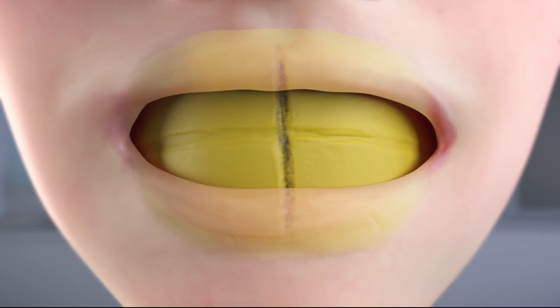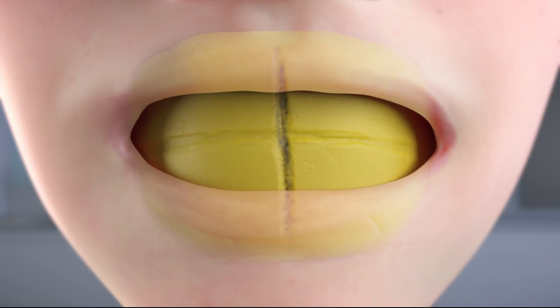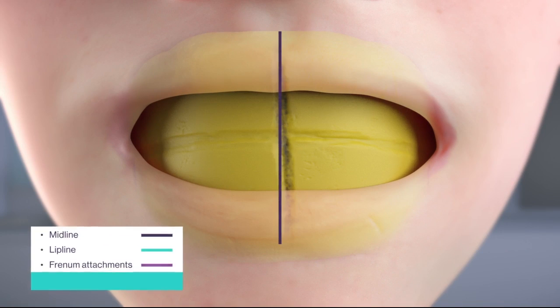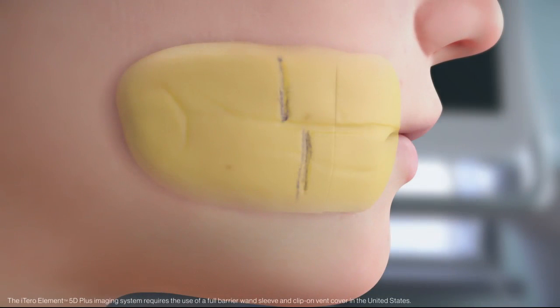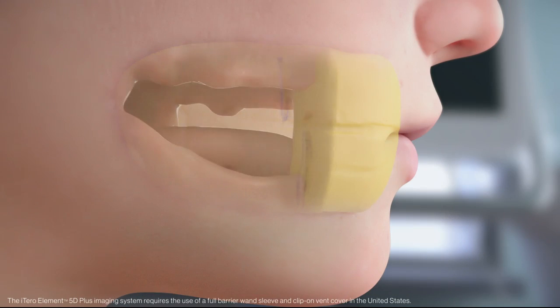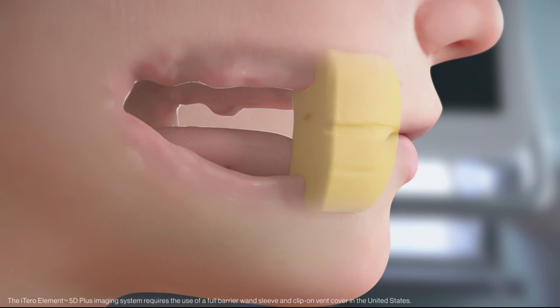Instruct the patient to close slowly. Once vertical dimension has been established, mark the midline, lip line, and frenum attachments. Trim and place the matrix at the anterior lining up the landmarks. Leave the contralateral putty in place when scanning the bite.